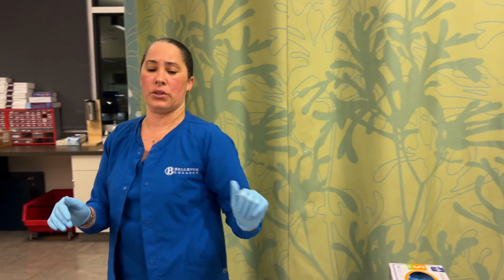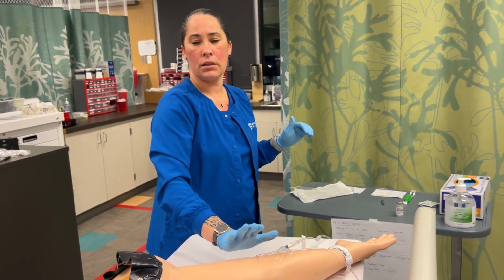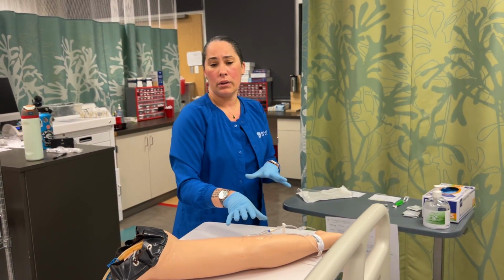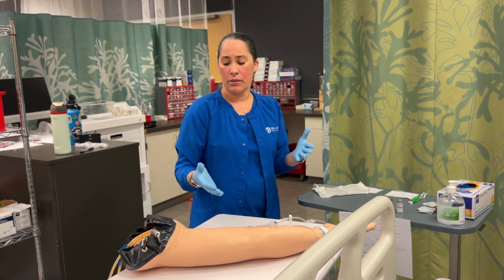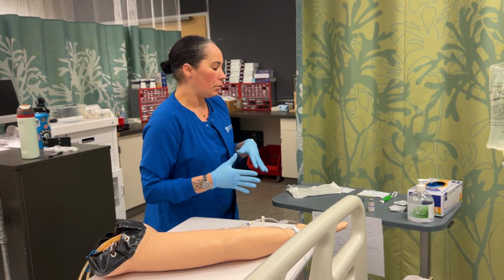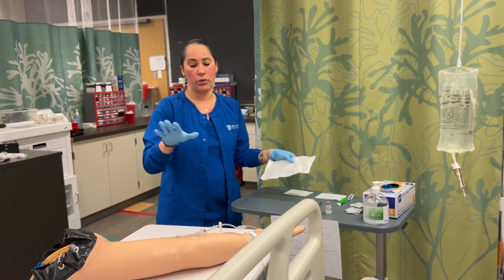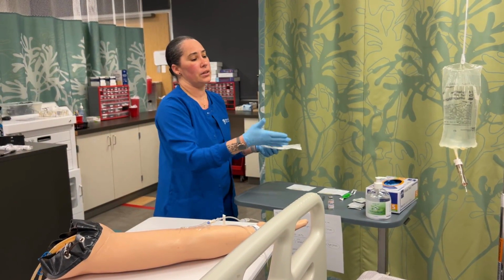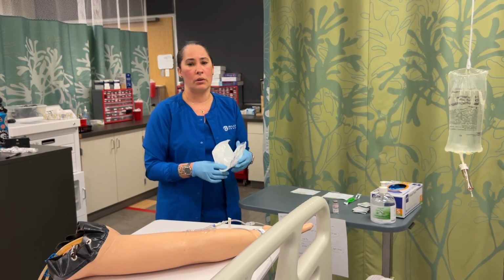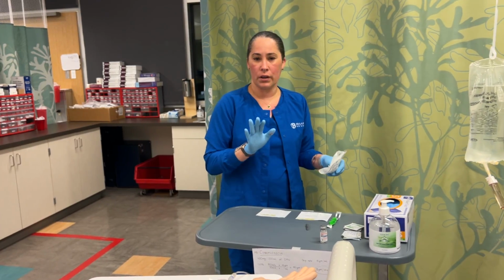Again, assess the patient's site, make sure that they are not having any redness, swelling, edema, or any pain with this. And again, have them let you know when they're feeling anything, any allergic reaction. Also, always make sure to check for contraindications before you give any kind of medication, even if it's just sodium chloride. It's just very good to be safe.